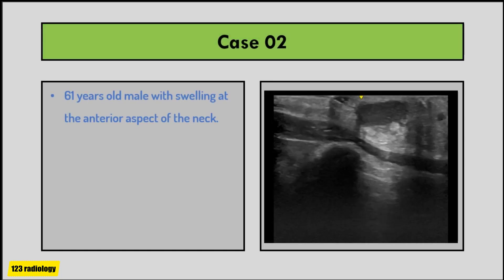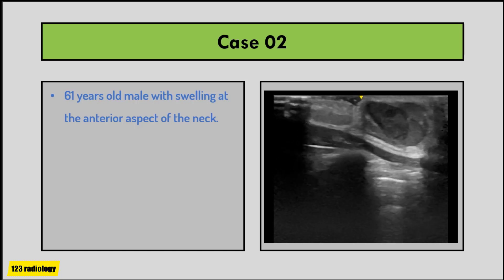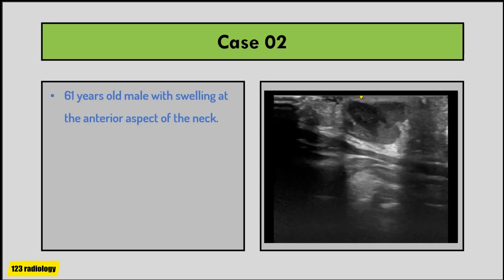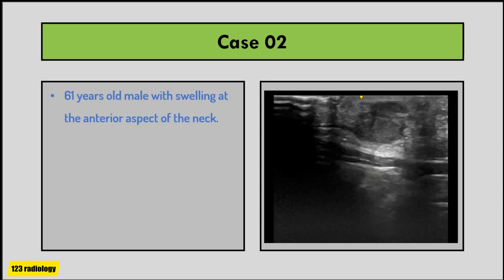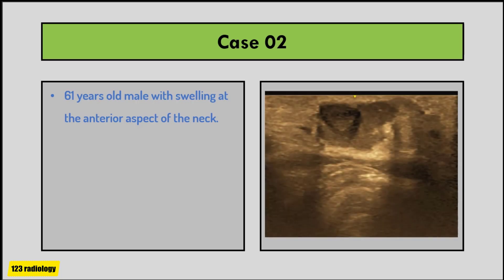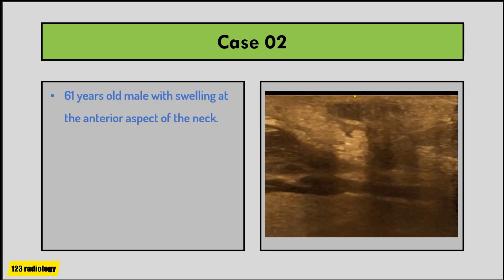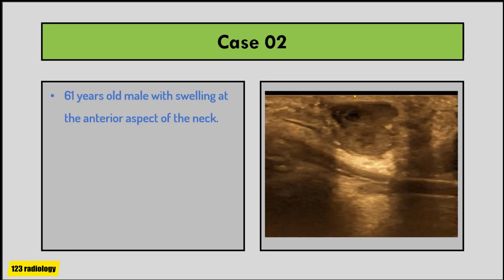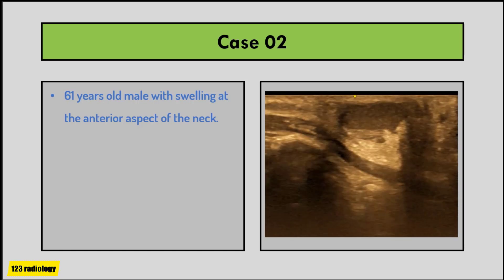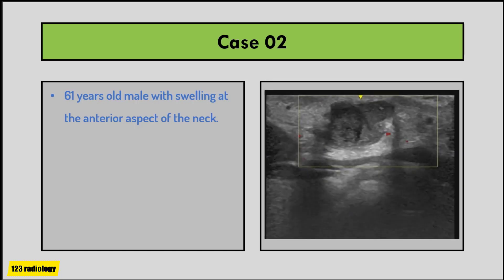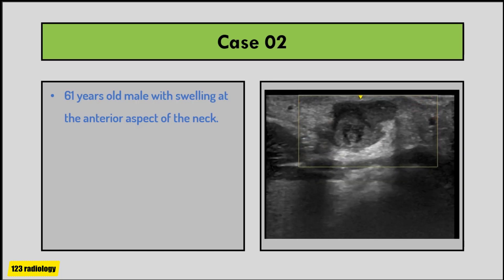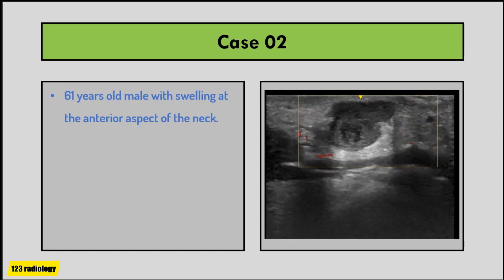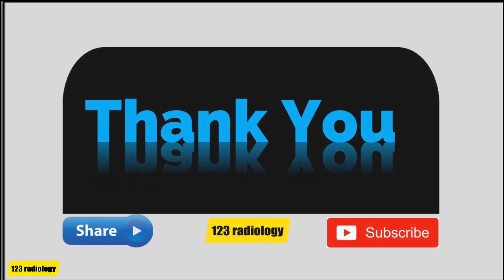Case number two: a 61-year-old male with swelling at the anterior aspect of the neck. In these cine clips there is a lobulated-shaped lesion with dermal attachment located in the subcutaneous layer, showing a mixed hyper- and hypoechoic echo pattern with posterior acoustic enhancement. On color Doppler examination there is no internal flow. These ultrasound features are highly suggestive of epidermal inclusion cyst, and the diagnosis was confirmed by histopathology.